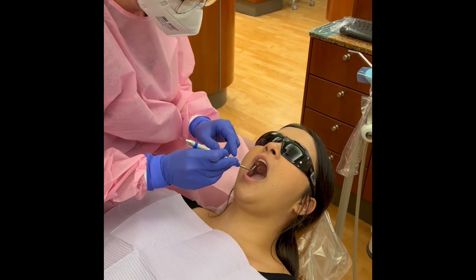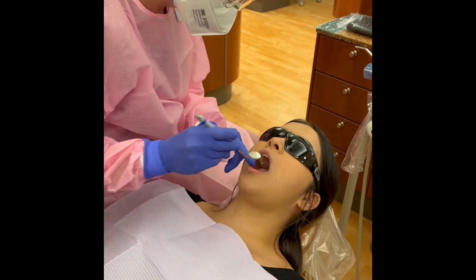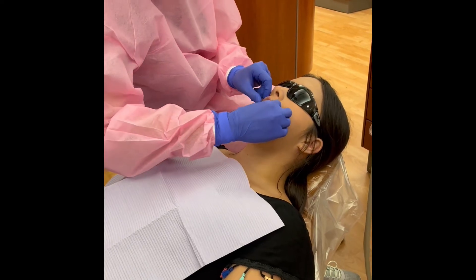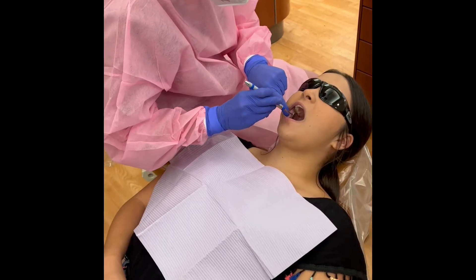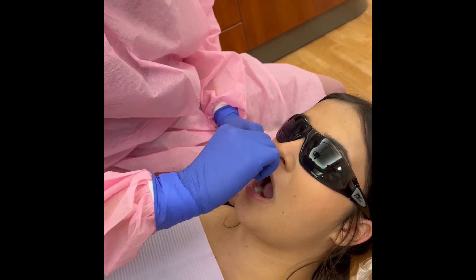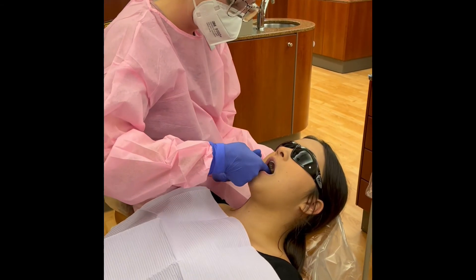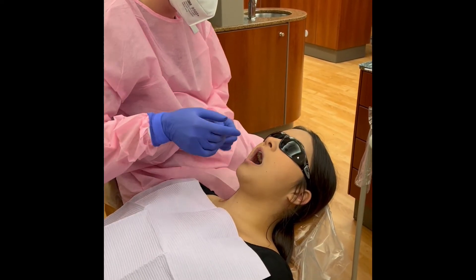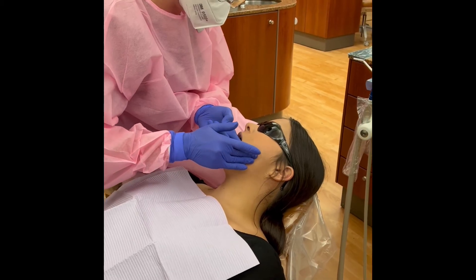Make a preliminary examination of the lips and intraoral mucosa using a mirror. Visually inspect the lips, frena, vestibule, and mucobuccal folds, then palpate by compressing between an index finger and thumb. Visually inspect the buccal mucosa of both cheeks, then palpate by compressing a finger on the inside against a finger on the outside of the cheek.